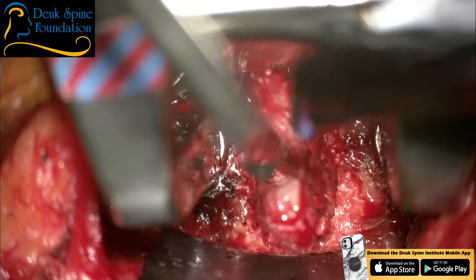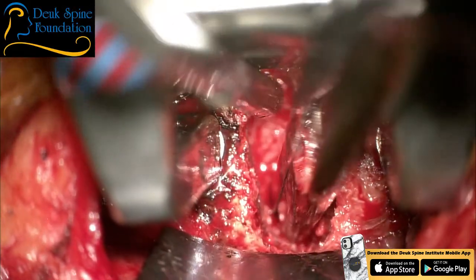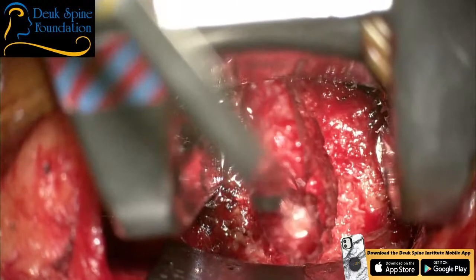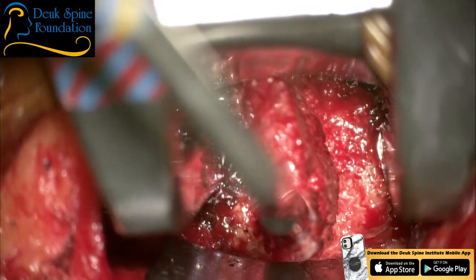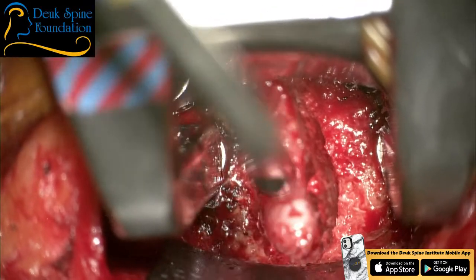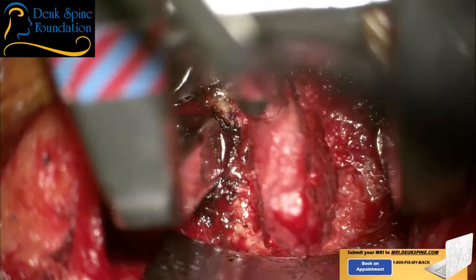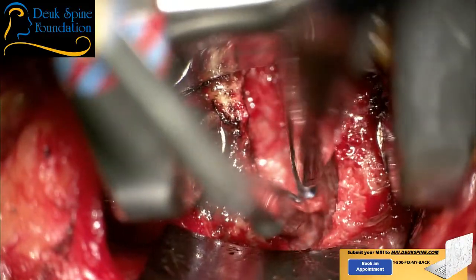Didn't he say, which side did he say he was worse? Left side. Left side? Wow. That's amazing because this is his right side. And it's definitely worse. Let me see a Kerrison smaller. So that white thing down there is the nerve root.